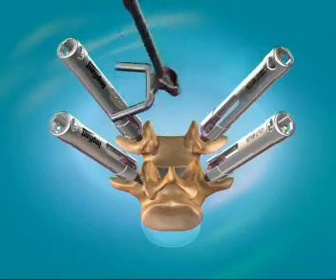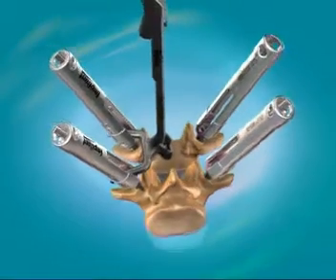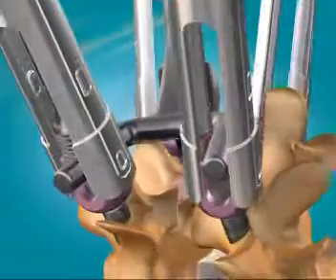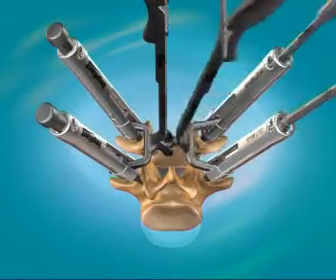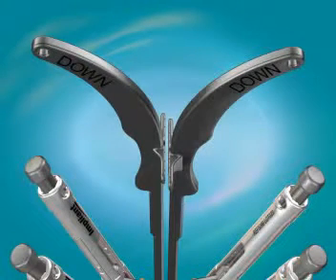Verify proper up and down orientation. First, take the female half of the gauge and insert it into the pedicle screw heads. Insert 2 temporary set screws to lock the gauge in place. Insert the male half of the gauge into the pedicle screw heads. Insert 2 temporary set screws to lock the gauge in place. Again, verifying proper up and down orientation. Confirm that you have matched the proper gauge for the specific vertebrae.